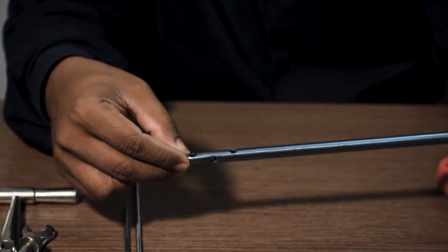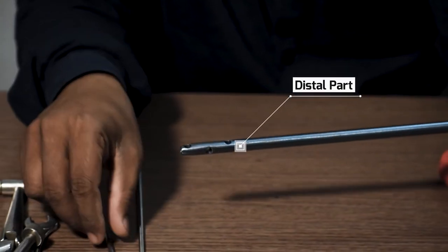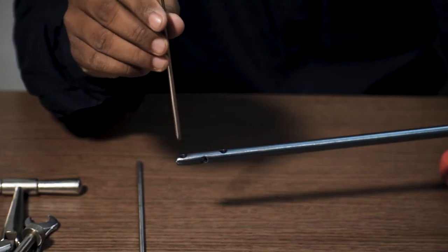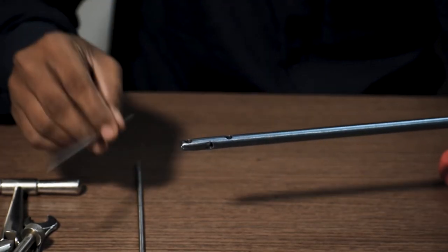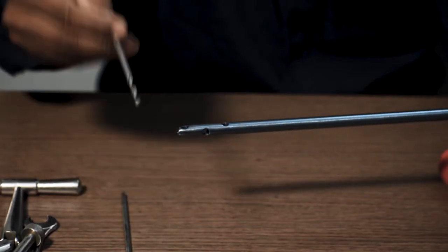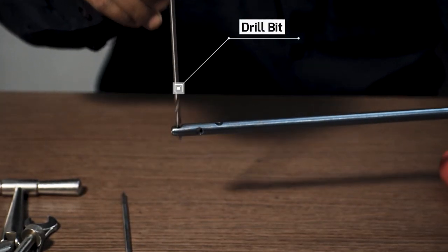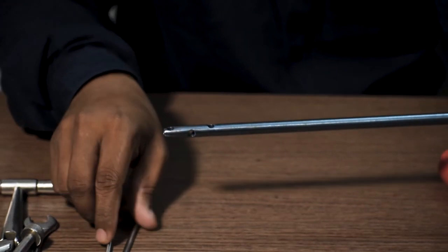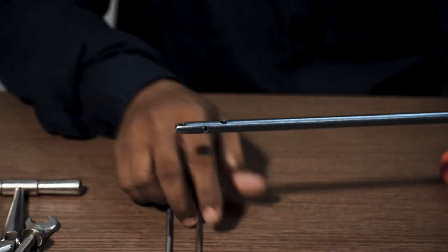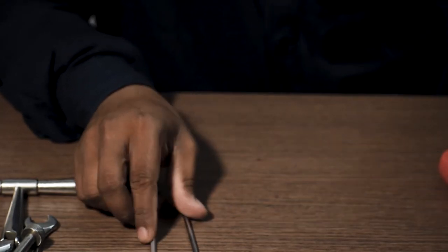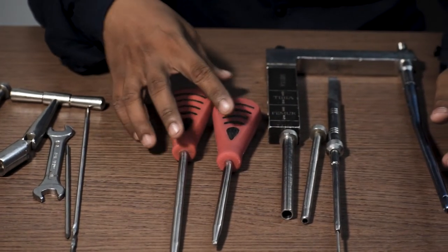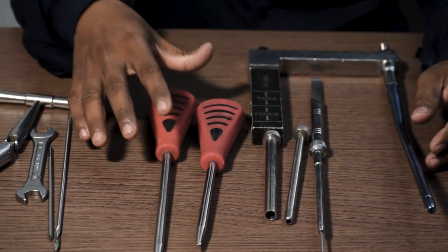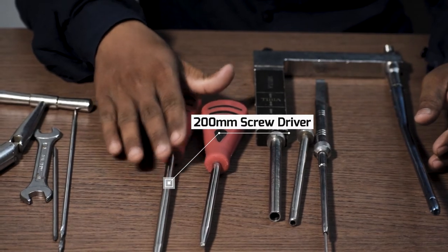This part is the distal end of tibia nail. Now surgeon can use either a Steinmann pin or a drill bit to drill through this hole. There are two variants of screwdrivers used for this tibia nail procedure: 200 mm and 150 mm.